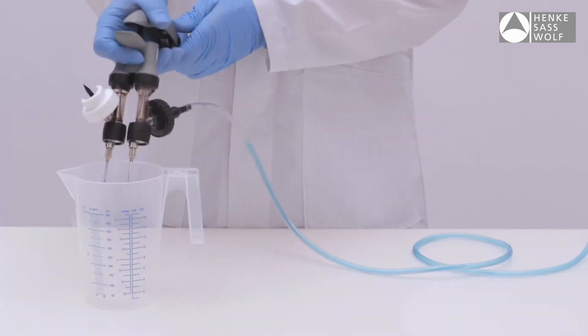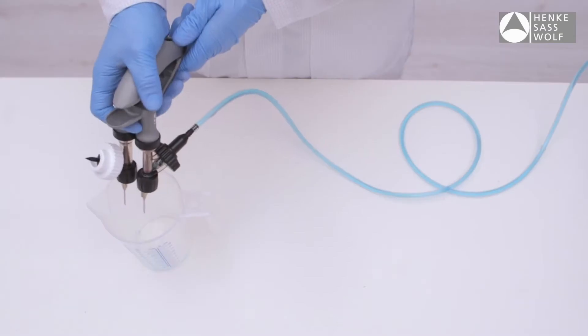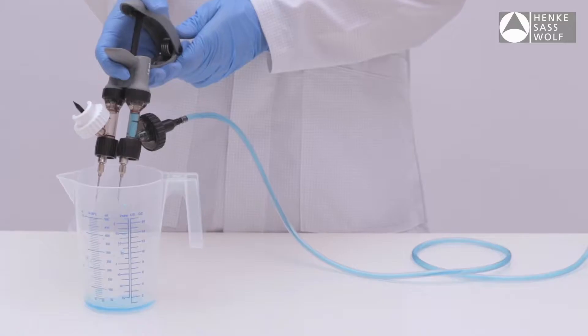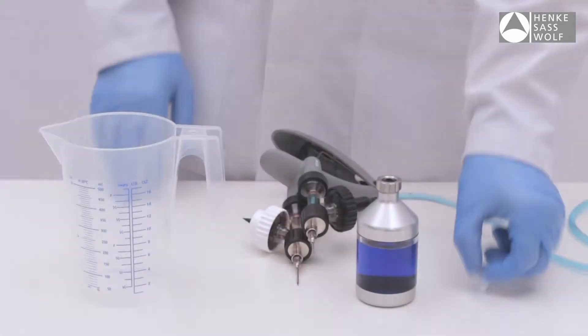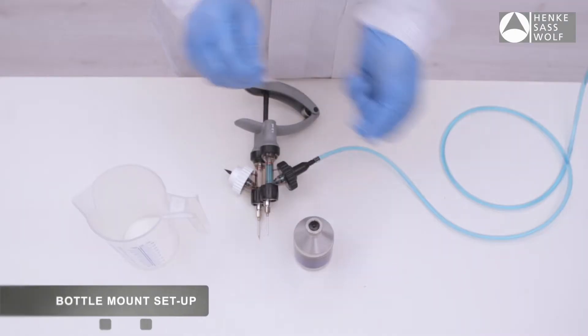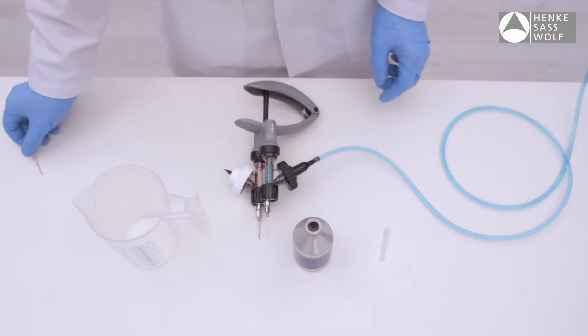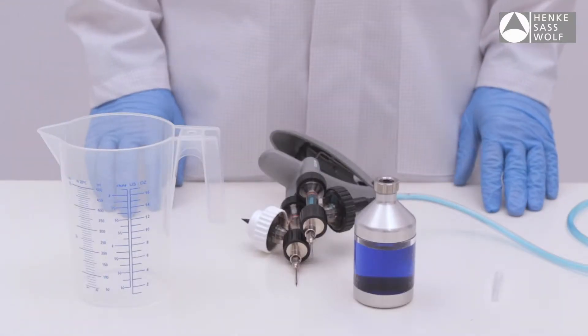With a bottle-mount tubing combination, it is recommended to partially prime the tubing side first, then afterwards the bottle-mount side. This will avoid product waste on the bottle-mount side during priming. It is recommended to make a pilot hole in the rubber cap of the bottle prior to connecting to the syringe spike. Use a sterile needle to puncture the rubber cap, then guide the spike through this hole.